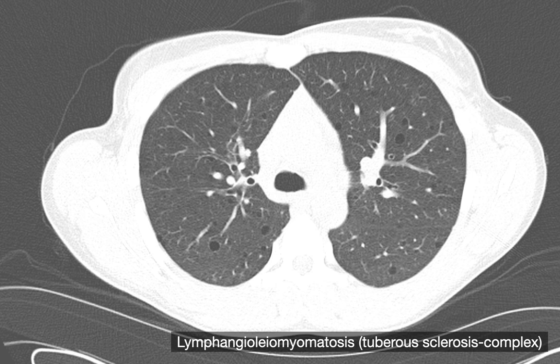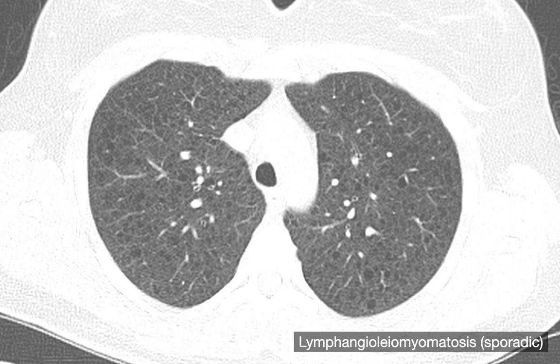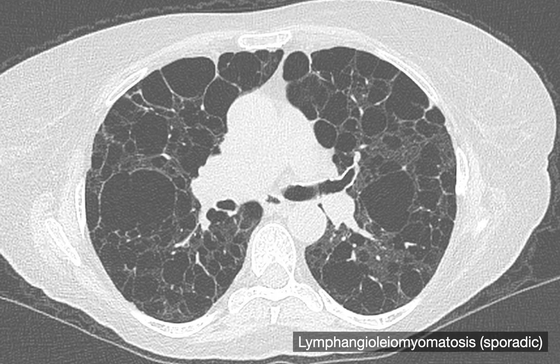Here are examples of cystic lung disease from LAM. One case shows a couple of round, thin-walled cysts in the lung that are pretty small. Another case has small, thin-walled cysts but much more numerous. Cysts can also be medium-sized or quite large at times. The number and size vary from patient to patient, but in general their morphology is similar: round, thin-walled cysts with no substantial upper or lower lung predominance.